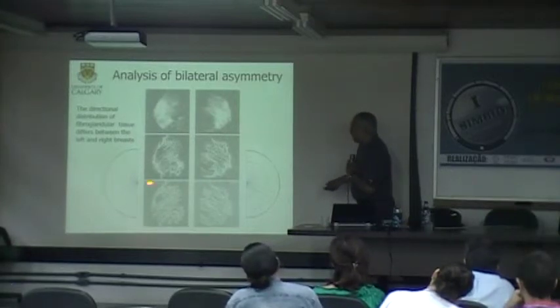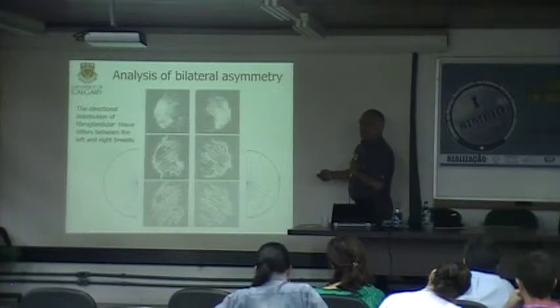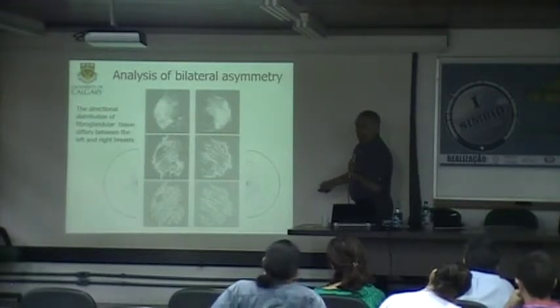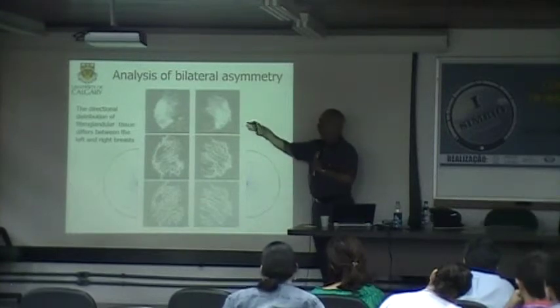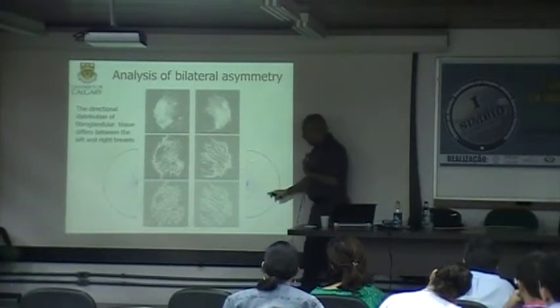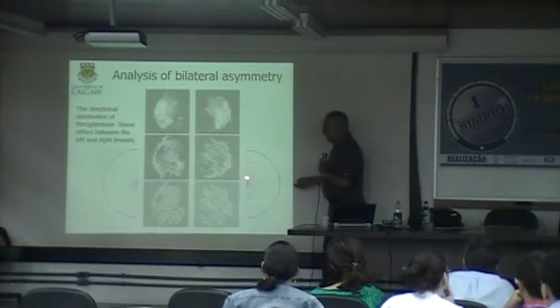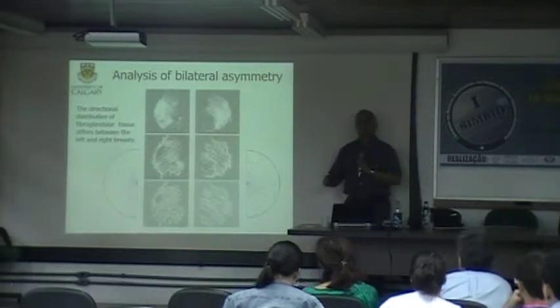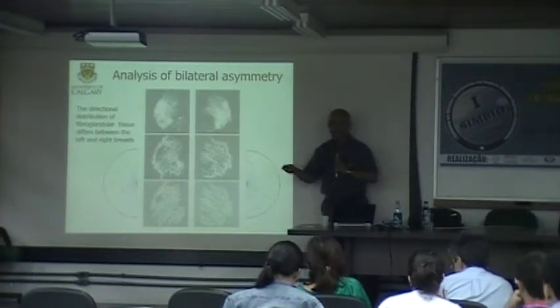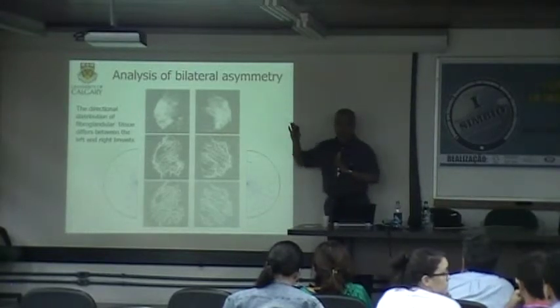So if you compare the two, they're different. Can you see the difference here? I don't know. Here you can see better. Very clearly, and this is quantitative, not just telling, oh, there is more this way, but objective. So quantitative, objective analysis: take this minus that, compute statistics, make a decision. Symmetric or not? So we showed that this can help in the detection of asymmetry.